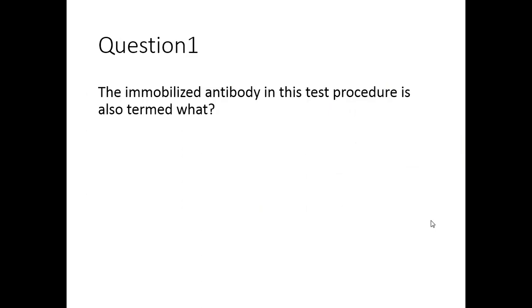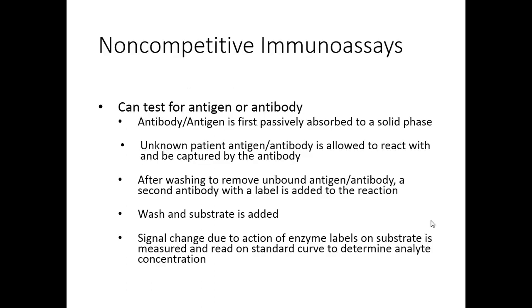So, question 1 for our in-class participation. The immobilized antibody in this test procedure is also termed what? We called that the capture antibody, right? That's going to capture the antigen in the test reaction.